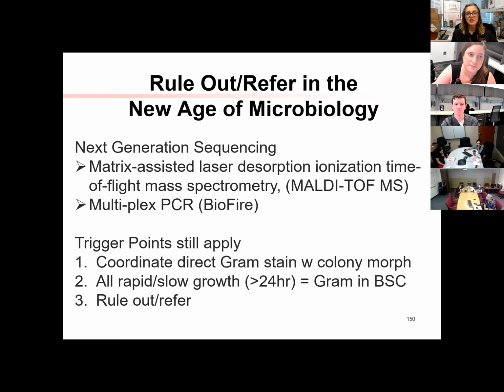The last thing I wanted to share is that, in the new age of microbiology, it is something that we're getting very used to, people doing sequencing and BioFire. So they begin to realize that it's so easy to identify it from that. But do remember, most of these organisms are not in that library. So they don't react much anyway. So it could be called another organism.